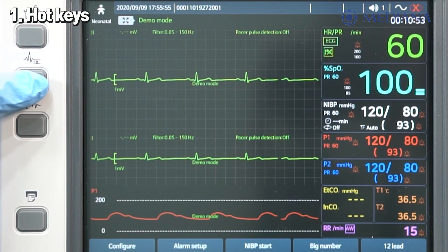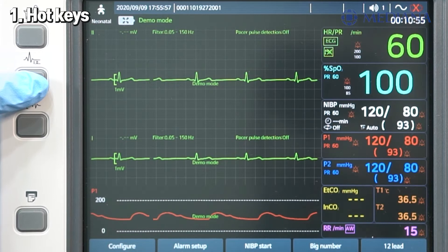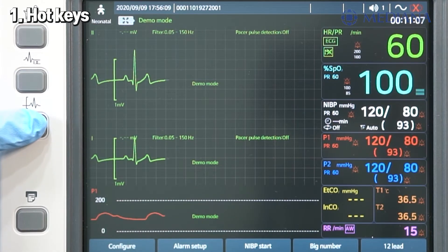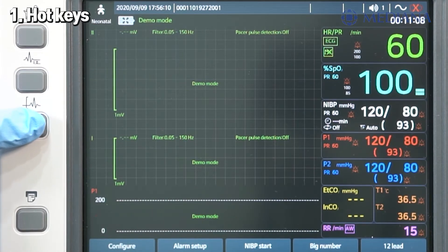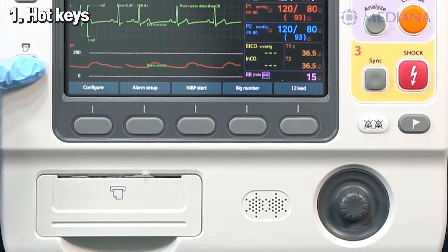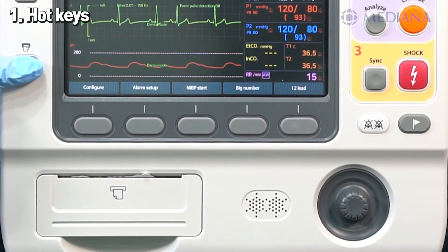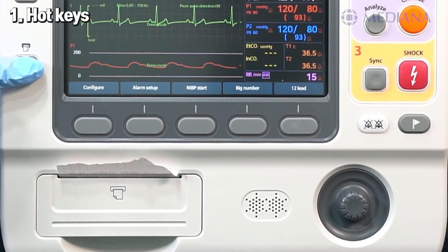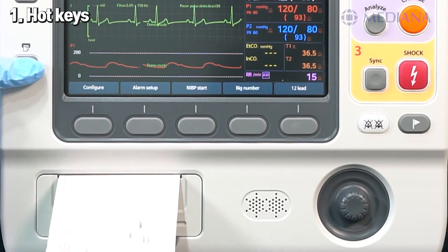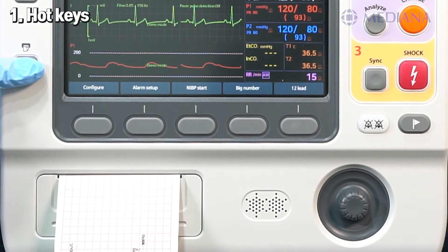The ECG lead button selects the lead to display the first ECG waveform on the screen. The ECG size button selects the amplitude of an ECG waveform. Press the print button for a continuous printout of the primary ECG and other selected waves with event annotations and measurements.